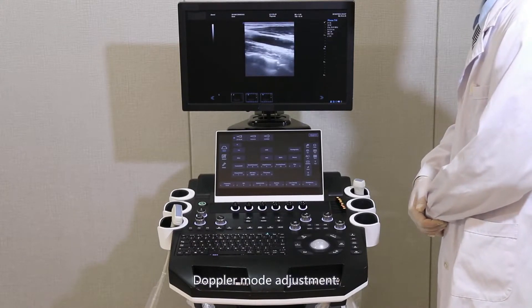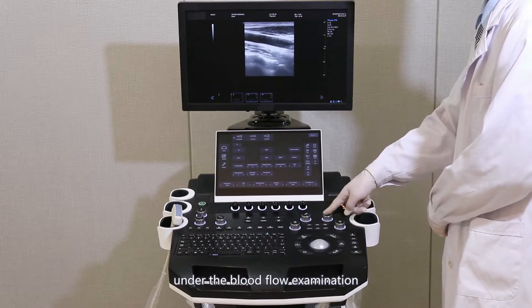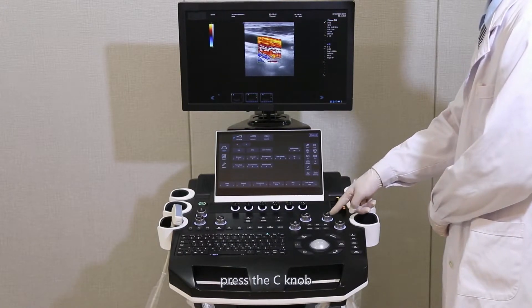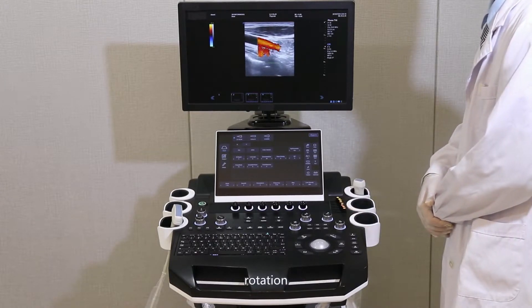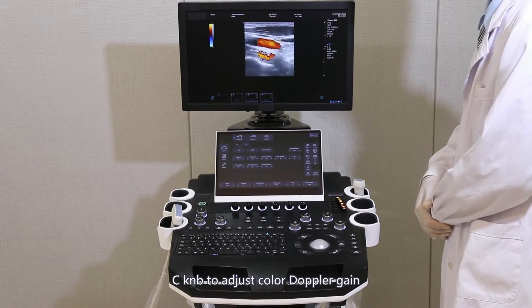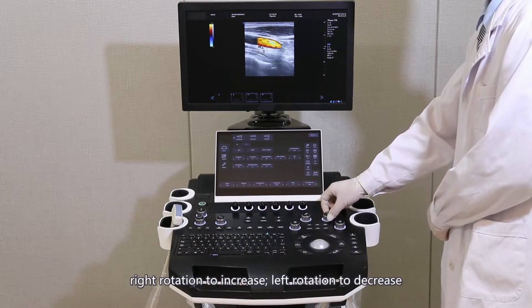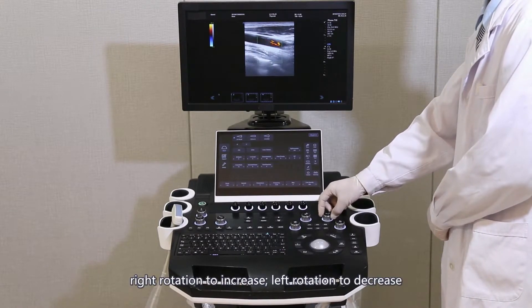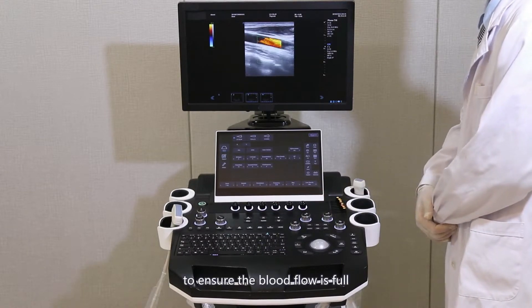Doppler mode adjustment: under blood fluid examination, press the C-knop to enter color Doppler mode. Rotate the C-knop to adjust color Doppler gain — right rotation to increase, left rotation to decrease — to ensure the blood flow is full.